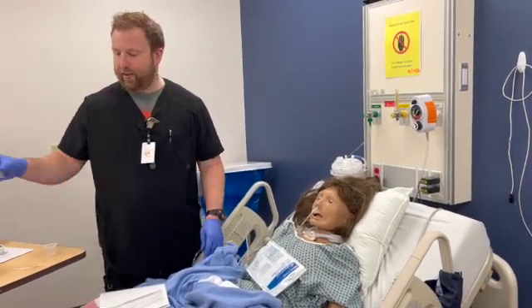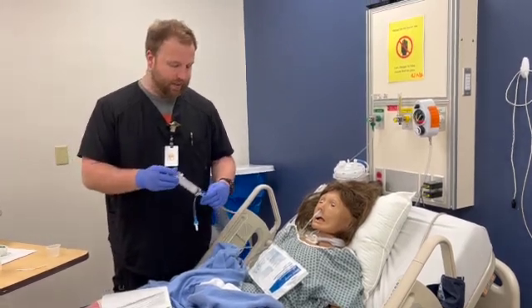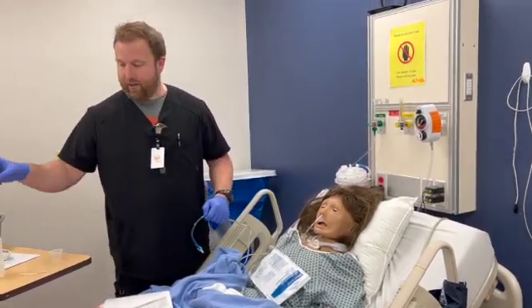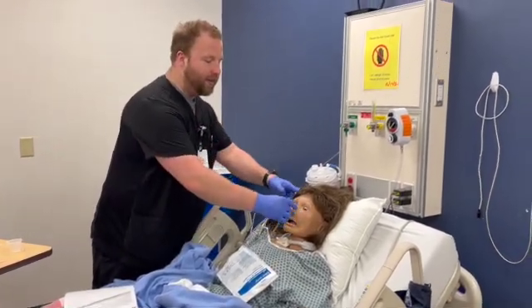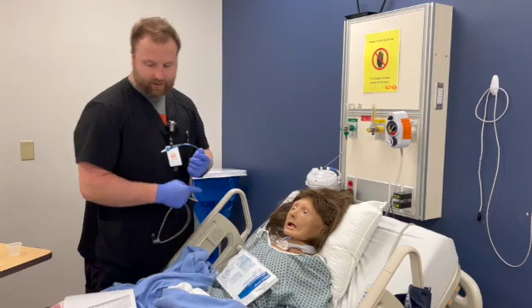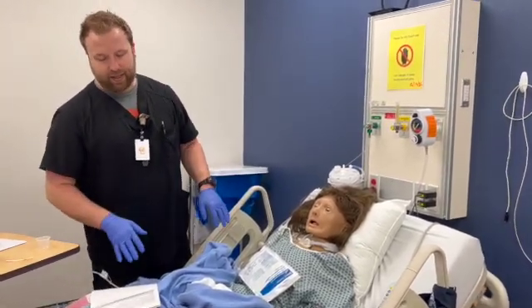It's in the right place. And I want to flush with 10 mLs of water. I flush. And the last thing I want to do is instruct the patient to take a deep breath. I'm going to kink it up and pull it out. I'm going to dispose of this per policy, take off my gloves, wash my hands.